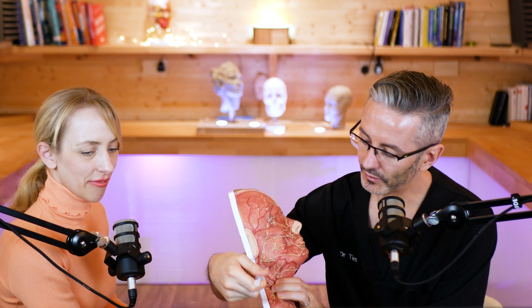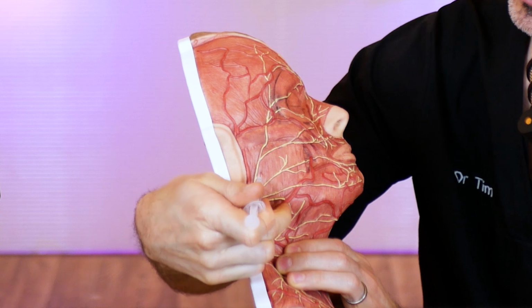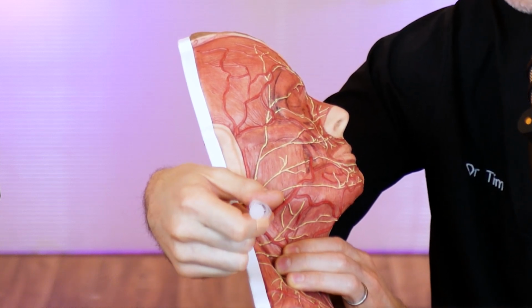You can see there are injectors who don't have a clear mental model, and they're very easy to spot by someone who does have a clear mental model, because I've seen a video of someone injecting jawlines, literally just going along. I'll show you on this model. Anatomy isn't quite right, but using a needle along the jawline, just basically piercing all the way down and bolusing along here, and right over here you've got the facial artery, and she might be lucky for 500 procedures, but eventually there's a really high chance you're going to hit the facial artery and block the whole blood supply to part of the face. And you'll see it on Instagram.